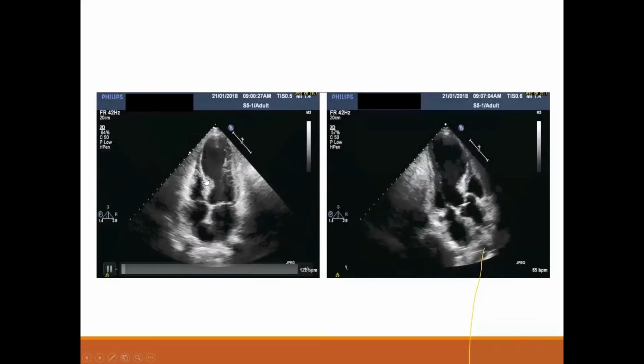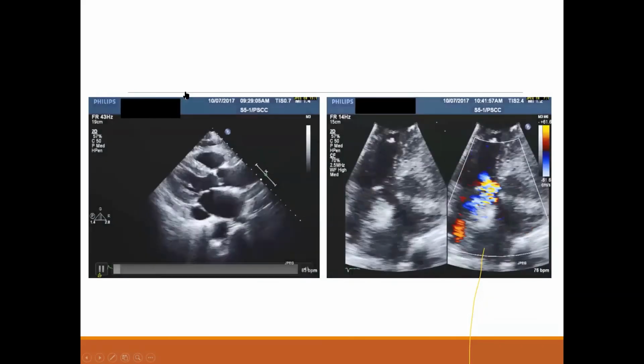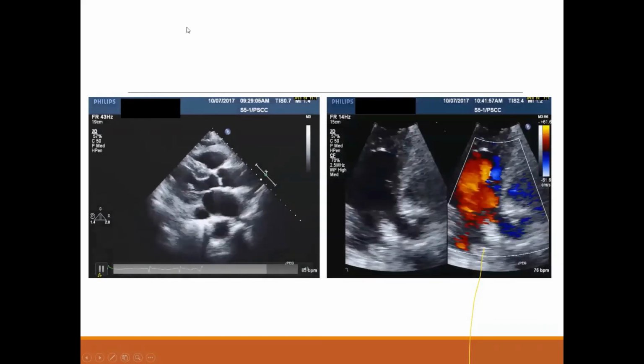Because here there is some thinning out, and this thinning out might not be viable, and this patient might not benefit from coronary angio at all, and therefore just medical therapy. So we shouldn't take this patient to the cath lab right away. Okay? Yes. Okay, now what is this?